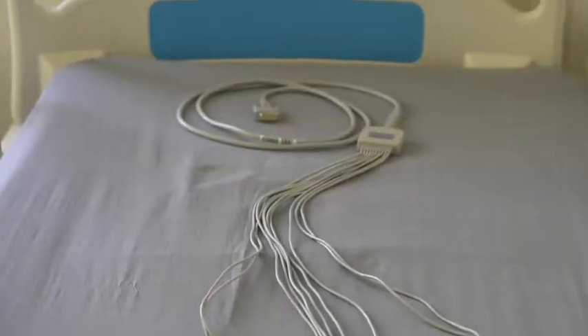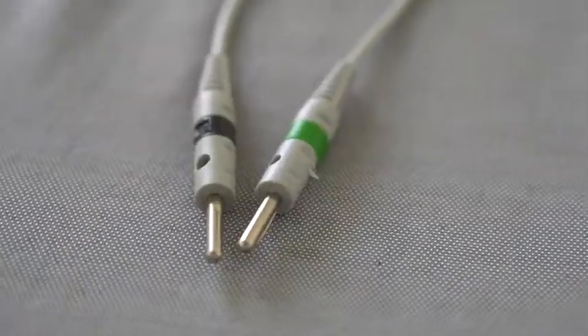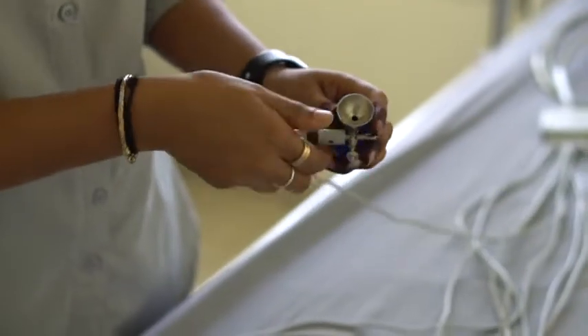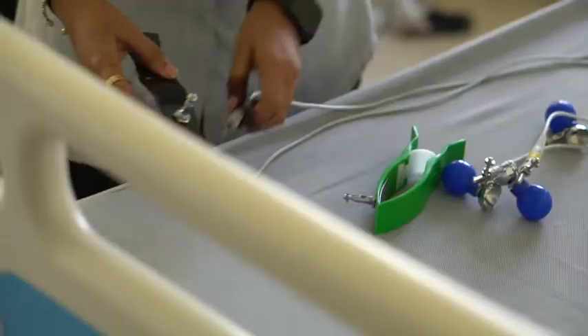Prepare the cable for use by attaching the cable management holders included in the kit. This will lead to less tangling. Then attach the 6 chest bulbs to the wires denoted by V1, V2 until V6.